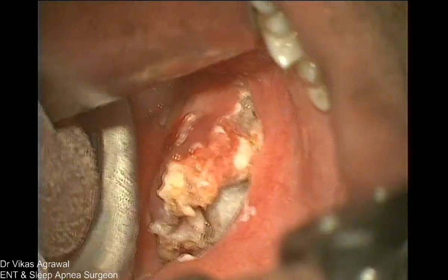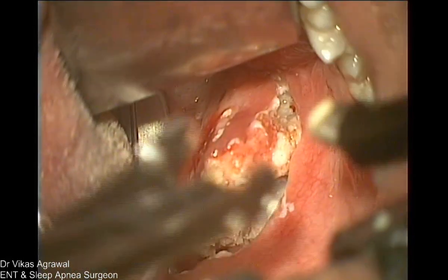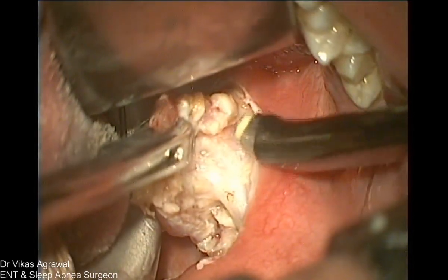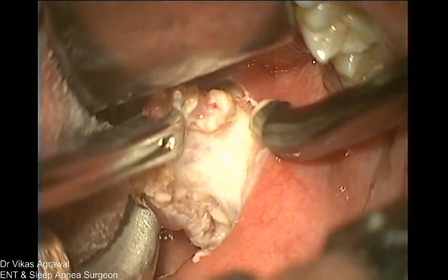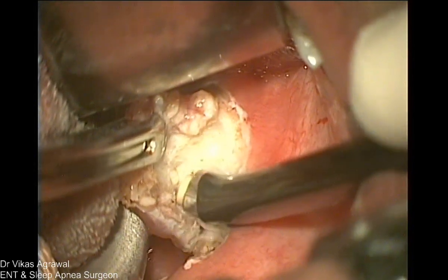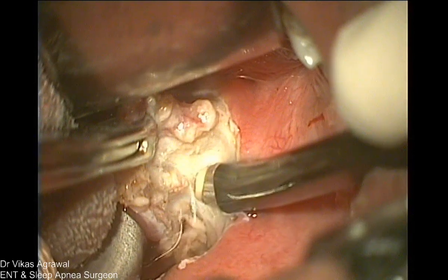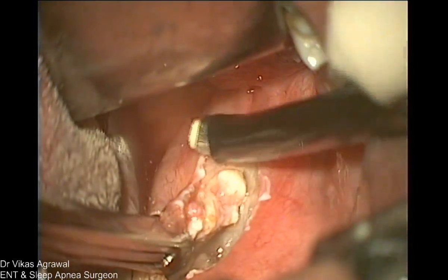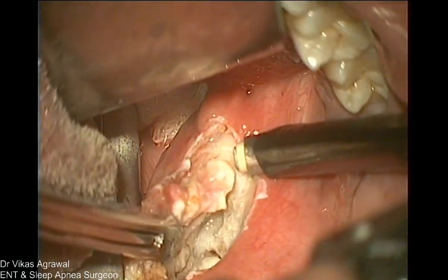So let me just finish off the palatal part here. Okay, so this is the tonsil. Now, any small vessel here you can coagulate, but the wand should be directed towards the tonsil and not towards the fossa. Right. Very, very important point there, because technology is as good as you use it. If you are going to dig the coblation wand into the tonsillar bed, it will induce bleeding.